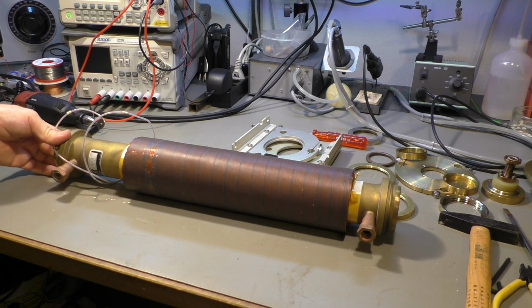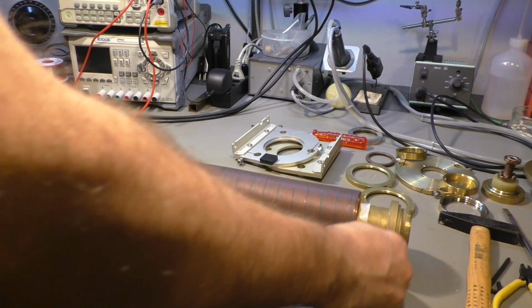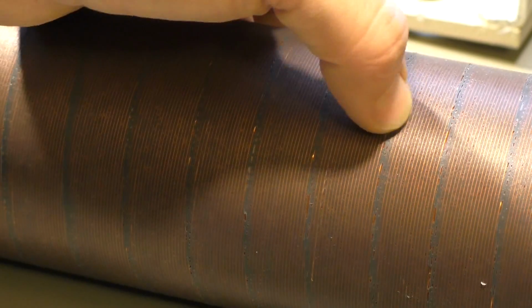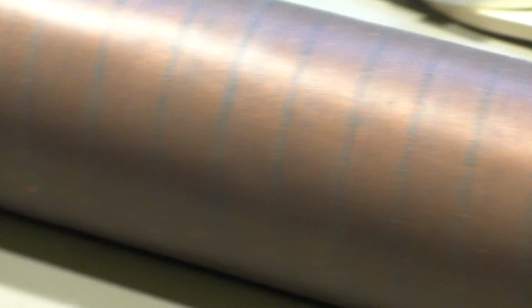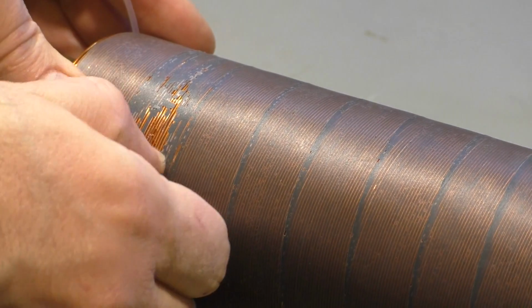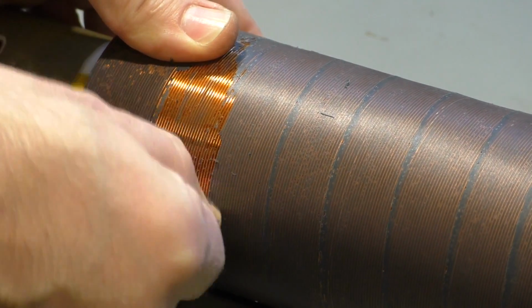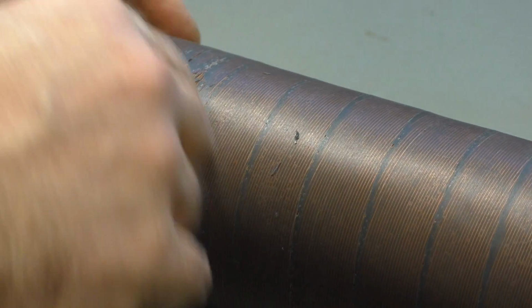Okay, now it turns out that that's the end of the teardown video so far, because this winding here has been soaked with some epoxy resin stuff. You can see it a little bit better here. Here is the copper with insulation, of course. Now it's some kind of rubber, like a silicone. It can be scratched away, so it's more like maybe against humidity or something like that.